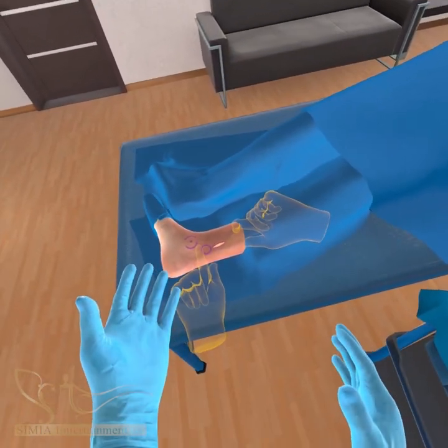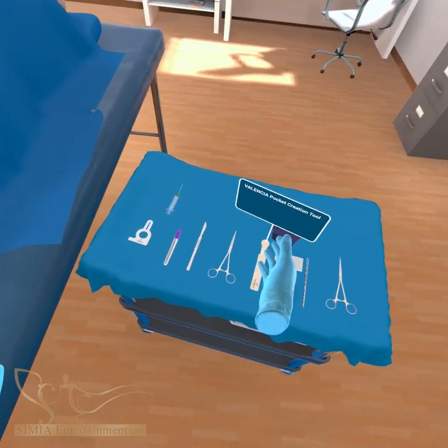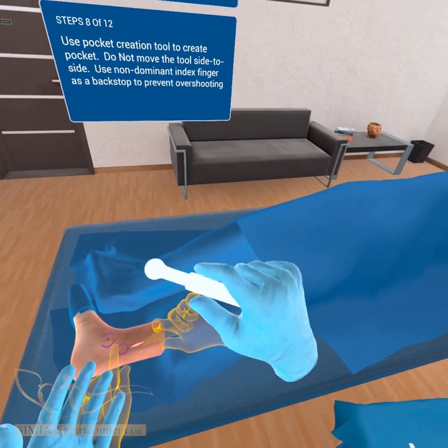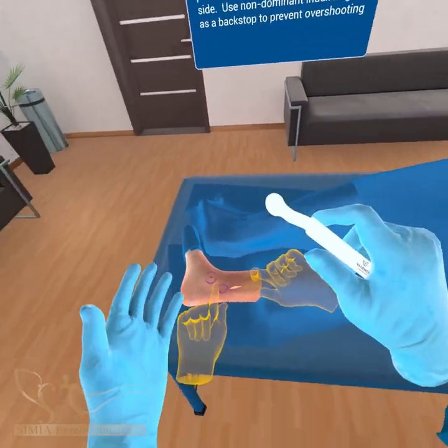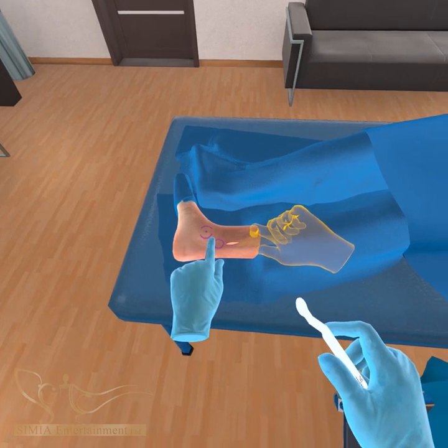Use the custom pocket creation tool to create the ECOIN pocket. Do not move the tool side to side once placed in the incision. Use your non-dominant index finger as a backstop to prevent overshooting the implant location.